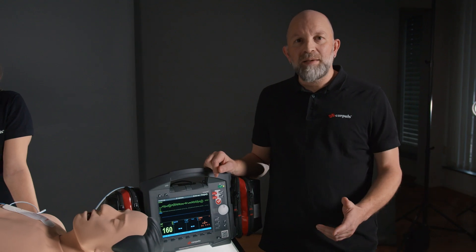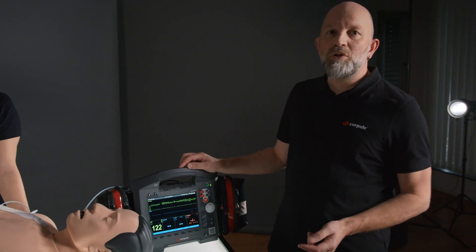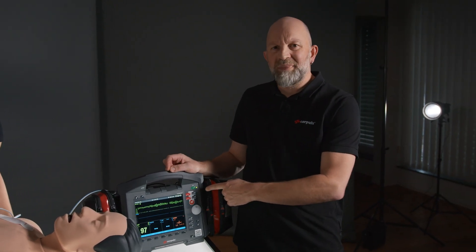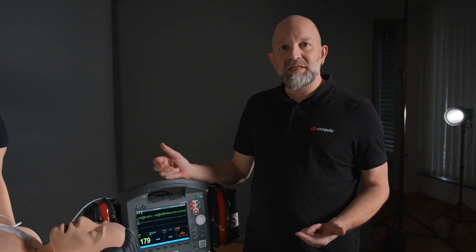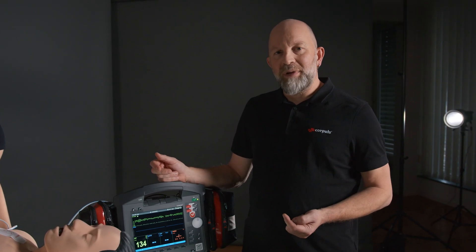In addition to the AED mode, the Corpulse 3 offers the option of manual mode. Depending on the operator, it may be necessary for the user to unlock this mode using an access code.